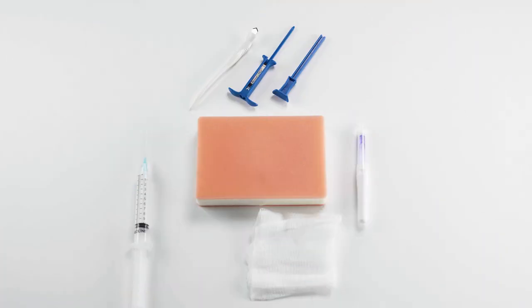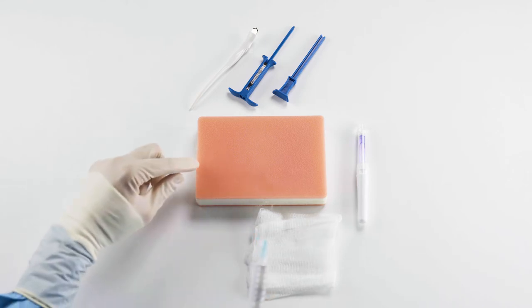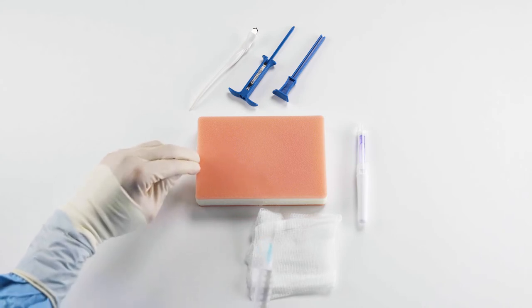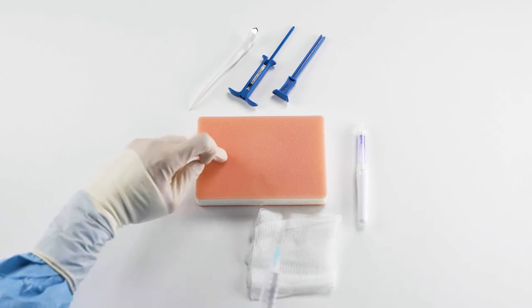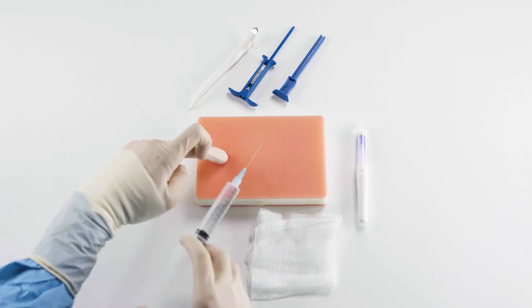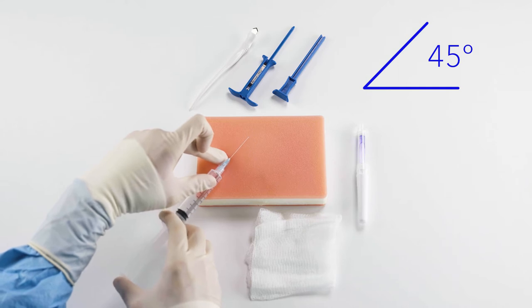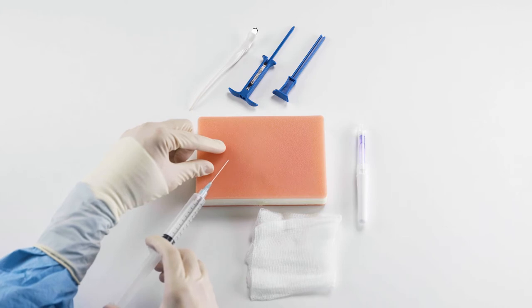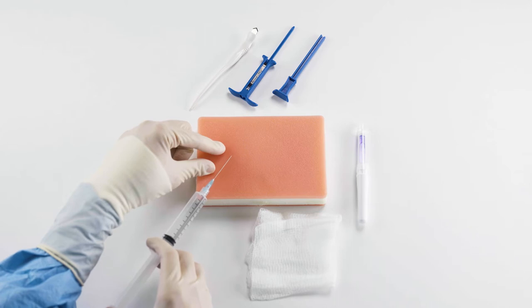Now that the chloroprep has dried, we can begin. I'm going to grab my lidocaine with a 25-gauge needle and I'm going to find the midline of my patient. I'm going to go two centimeters to the left at the left parasternal line and palpate down to the fourth intercostal space. Once there, I'm going to visualize a 45-degree angle, which is going to be my ideal insertion of the ICM. I'm going to tell the patient they're going to feel a little poke, and I find patients tolerate this better if I inject the needle as they're exhaling.